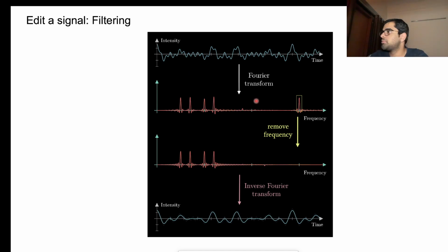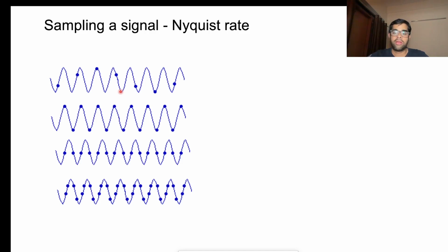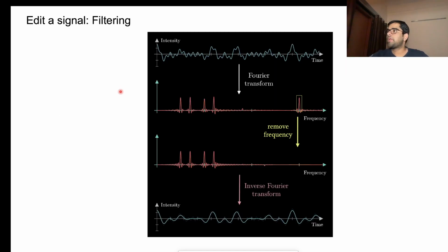I hope this picture is more clear of what the frequency domain means. Yes, it's very clear. Yeah, cool. So this is the filtering part that we generally use in pre-processing steps. Okay, I hope this is clear. If anyone has any doubt or any queries until this, you can ask, please.